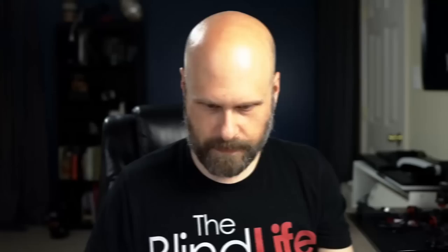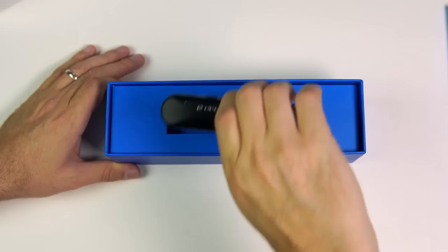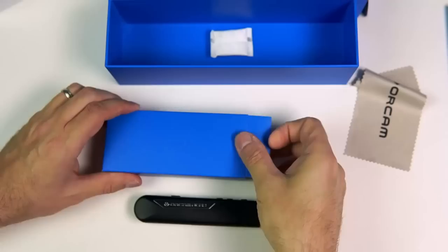So first, let's take a look at what comes in the box. Then we'll do an overview of the OrCam device, and I'll give some demonstrations of how it works. At the end of the video, we'll come back and I will give you my opinion of the OrCam Read. The OrCam Read comes in a very nice, high-quality box. Inside the box, you have a little section with information in it, then the OrCam Read device itself. Below that, you have a microfiber cleaning cloth, a charging plug, a USB Type-C charging cable, a set of earbuds, and a lanyard.